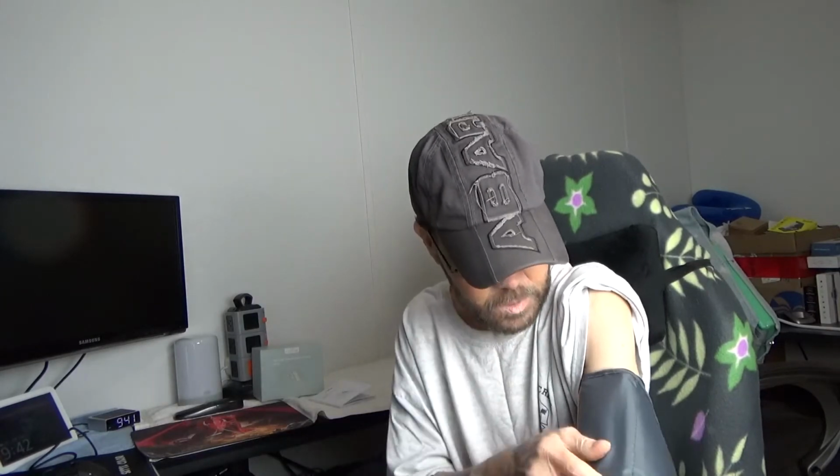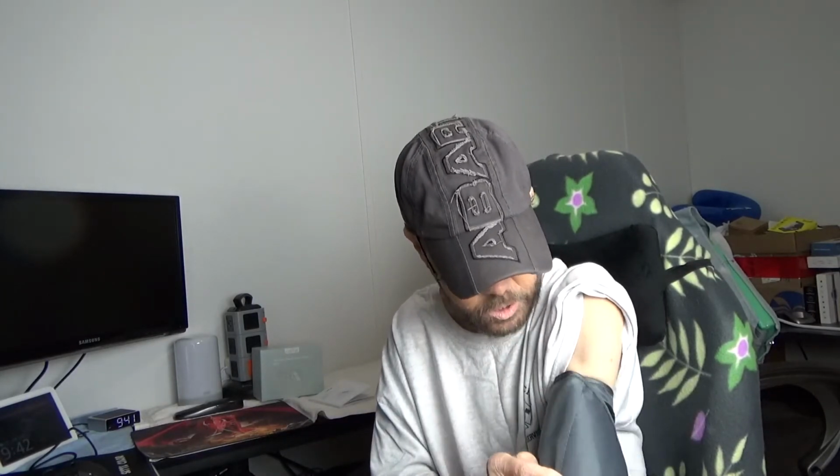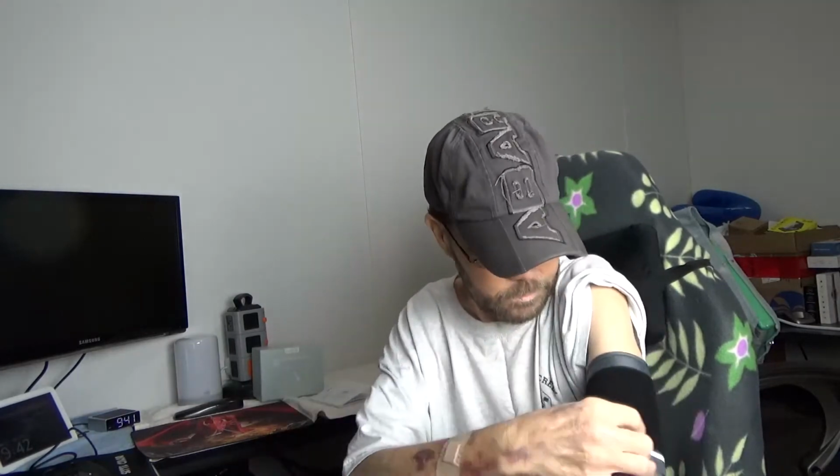See, I actually am getting an error. My blood pressure is probably so low and my arm is so small. See, got an error message. I can't actually fit very large cuffs. This is a medium. I usually need a child's size cuff because of the medical issues I've been dealing with a lot lately. So let's see if I can readjust this a little bit. And I'll show you what that looks like.